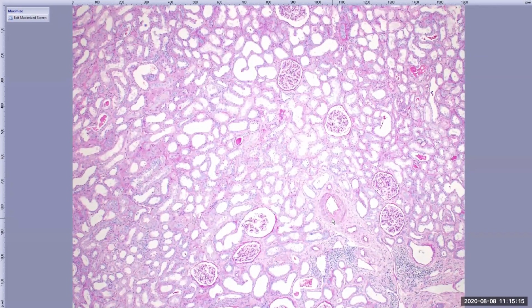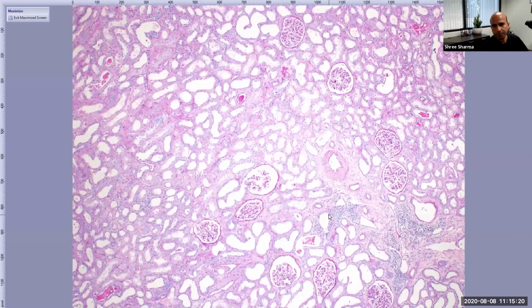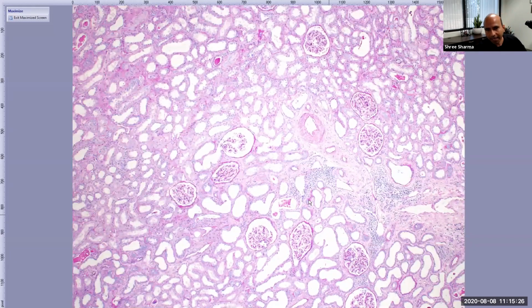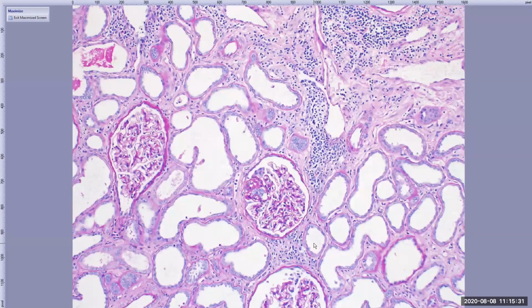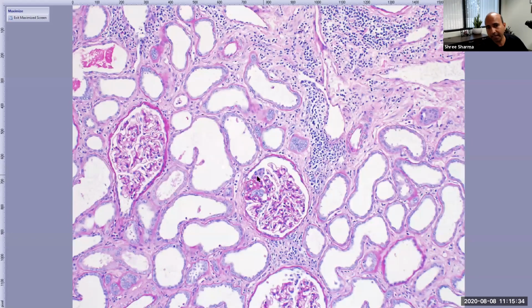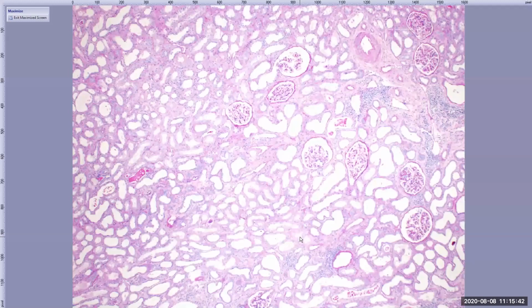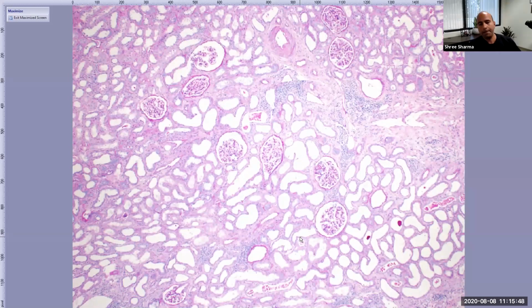Shree, what was that clump of cells that was kind of right next to that sclerosed area? Right here, they were all lymphoid cells. So over here, yeah. So the background is pink. No, within the glomerulus. Are those podocytes, or what are those? Yes. So over here they are the epithelial cells, which are proliferating in reaction to the sclerosis. Yes. Right, because in FSGS we know that we have hypertrophied podocytes. Usually in other disease processes we can't even see the podocytes on light microscopy. Yeah. So you are having hyperplasia and hypertrophy of the epithelial cells, which are lying over the tuft.